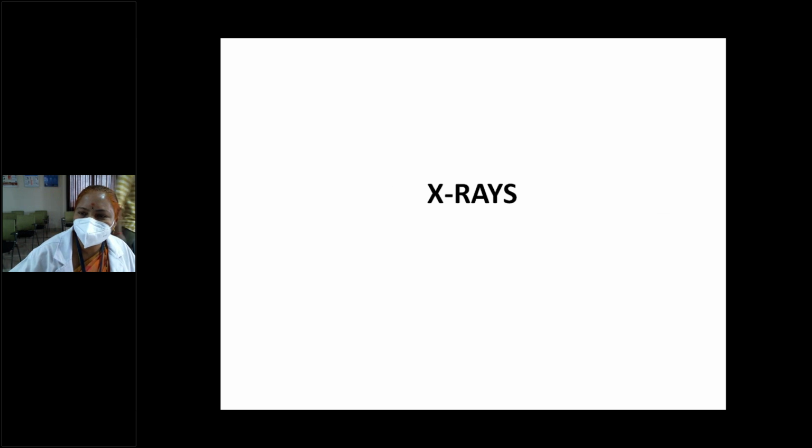Good morning, everybody. In the previous class, I dealt with around 20 X-rays. Now, I will discuss the remaining X-rays. These X-rays are very important for your orals, so all of you concentrate and try to interact with me. If you have any doubts, you can stop at any level and clarify them. Okay?